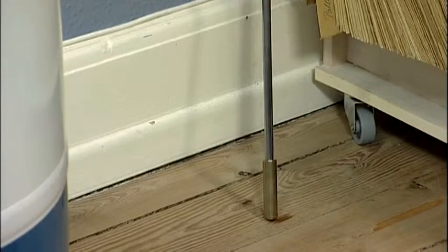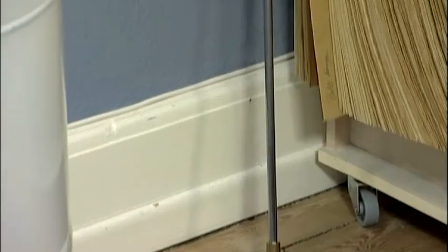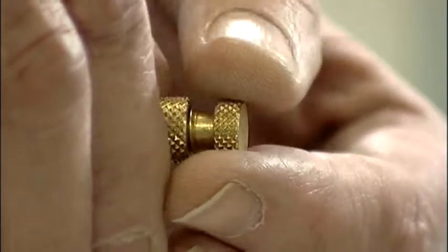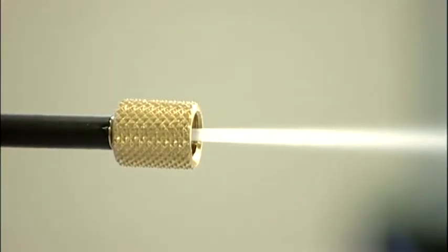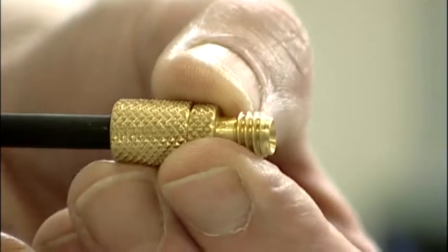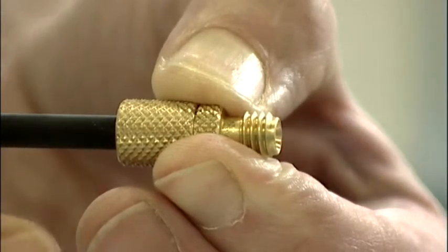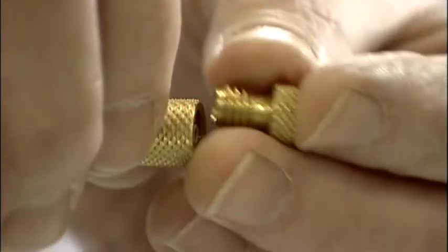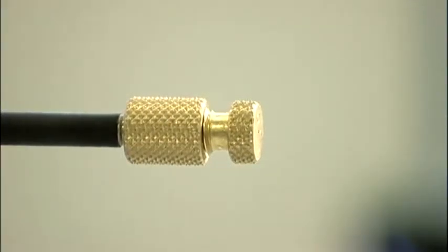Withdrawal devices are equipped with a filter. A clogged filter on the withdrawal device needs to be replaced. Simply unscrew and replace. A clogged spray aperture can usually be cleaned easily. Unscrew the aperture, initially clean the spray tube and then blow the tip clean in the reverse direction with liquid nitrogen by holding it firmly against the spray tube. Pay attention, escaping nitrogen may cause frostbite.